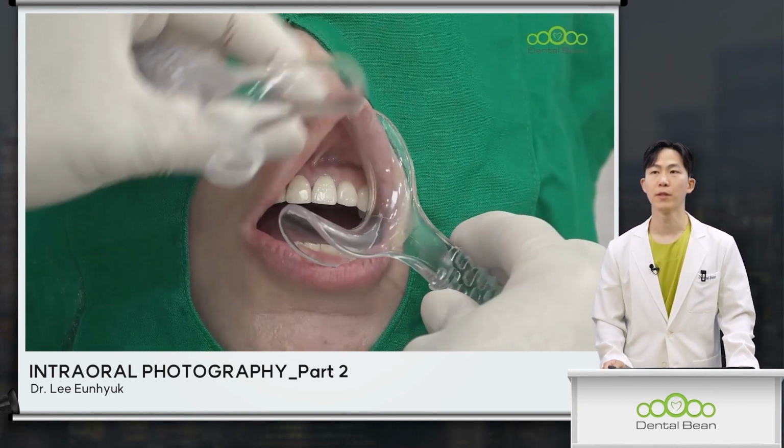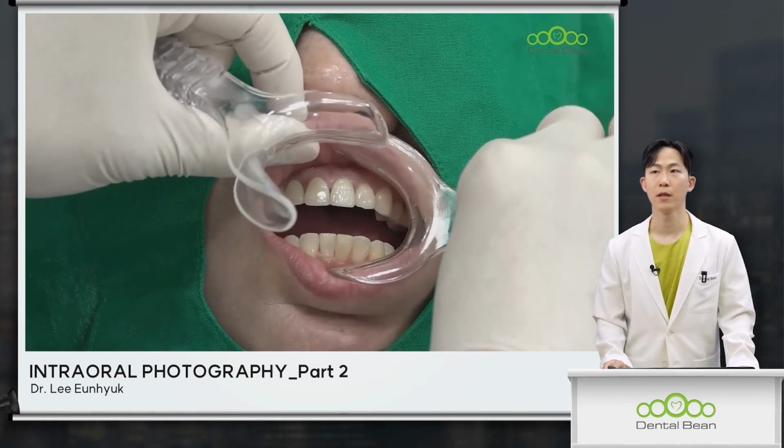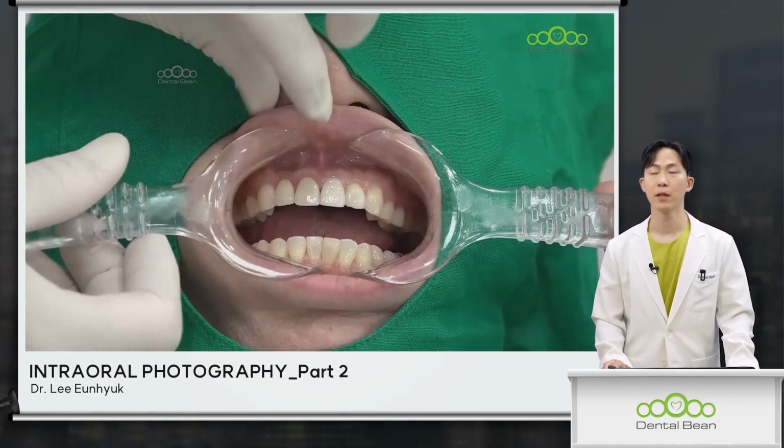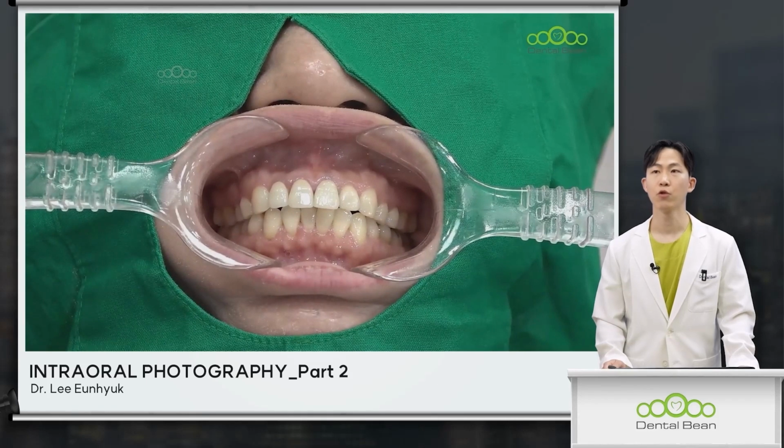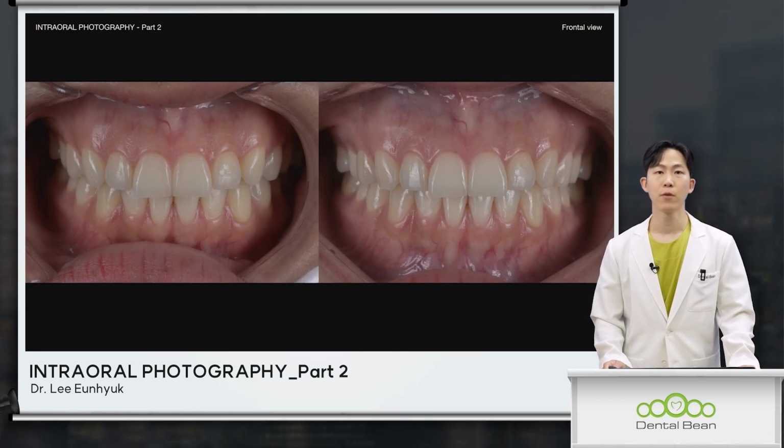The method to resolve this is to change the retractor size. Therefore, by positioning a large retractor and instructing the patient to close their mouth, you will observe that the previously drooping lips are now firmly drawn back and held taut, no longer sagging. Therefore, if you compare these two images, you will notice a significant difference in the degree to which the lips descend when utilizing a small-sized retractor compared to a large-sized retractor.